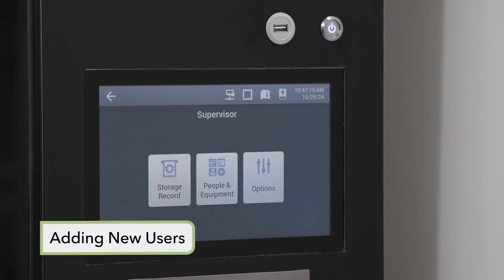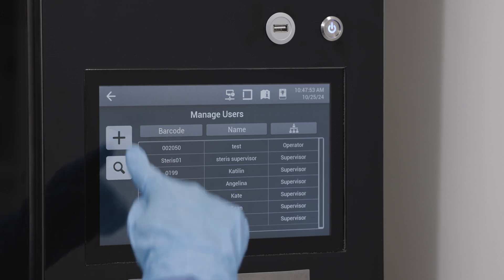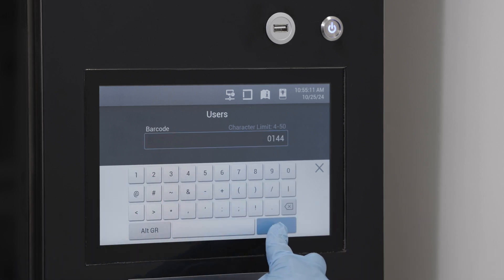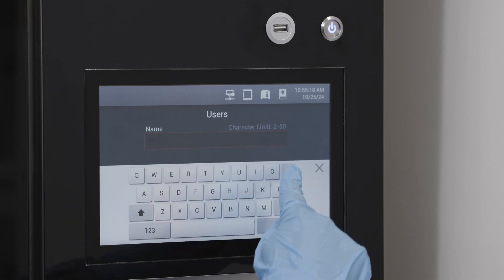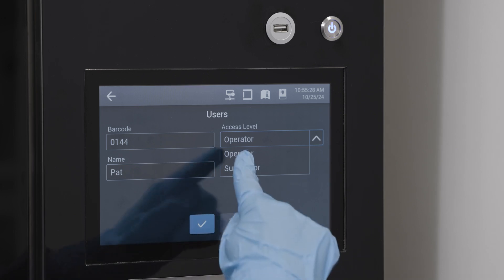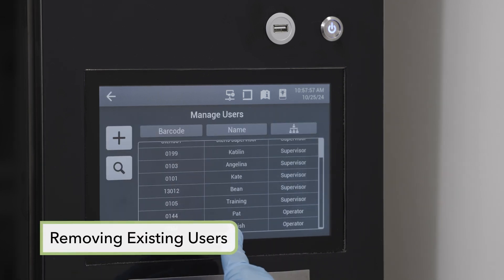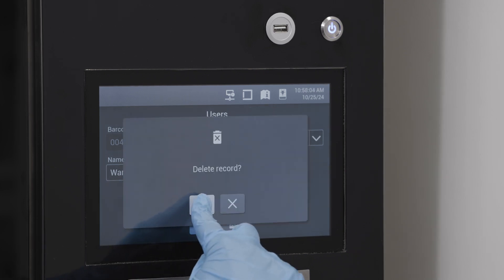To add new users to the cabinet, in the supervisor menu, select people and equipment and then the manage user screen. Tap the plus icon. In the user screen, tap the barcode field to display the ID barcode options. Enter the user ID via the barcode scanner or manually via the virtual keyboard. Tap the name field and type in the user name using the virtual keyboard, then confirm using the checkmark icon. Select the access level for that user as either operator or supervisor. Then select save and tap the checkmark icon in the confirmation dialog box. To remove a user, enter the manage user screen, select the profile to be removed, select delete in the displayed dialog box, and confirm in the further dialog box.